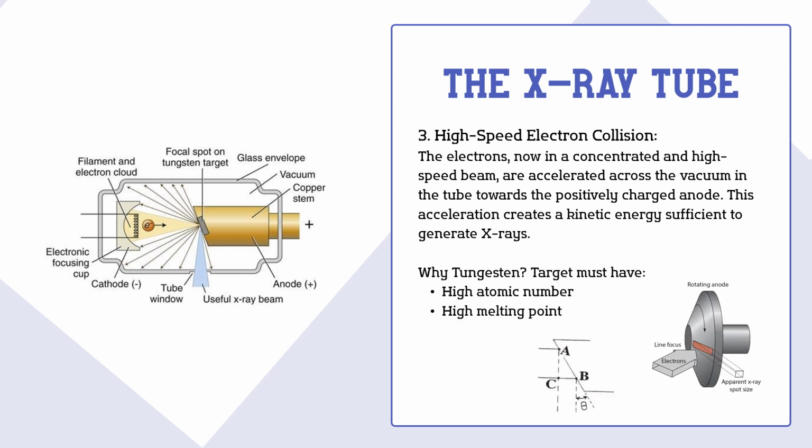Rotating anodes are used in diagnostic X-rays to reduce the temperature of the target at any one spot. Focal spot: the anode or target area from which the X-rays are emitted. In diagnostic tubes, it is important to have a small focal spot to produce sharp radiographic images. For therapeutic use, a large focal spot is accepted because the image quality is not a concern.